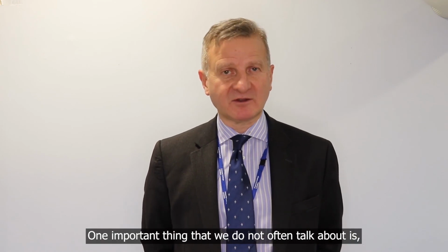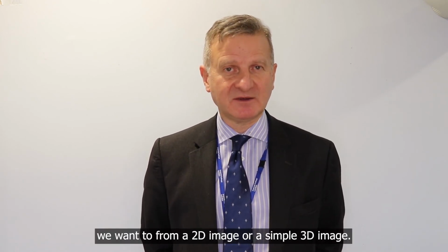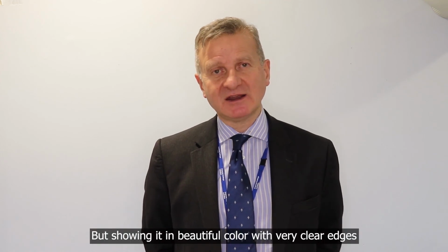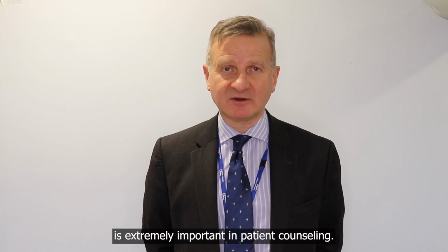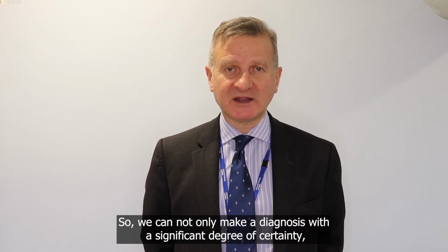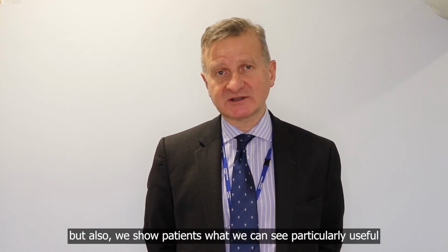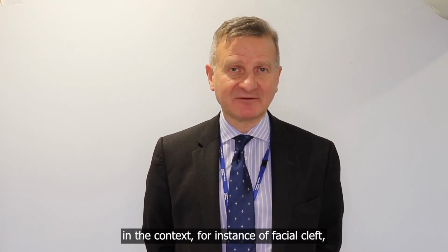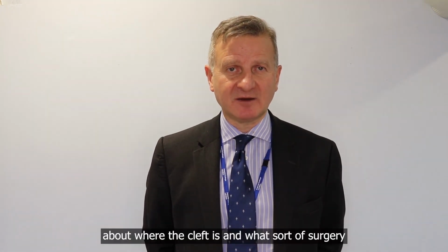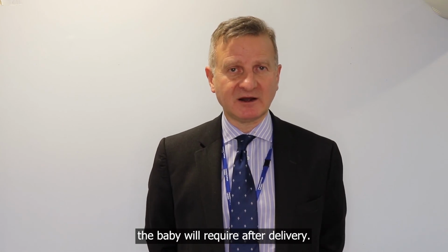One important thing that we don't often talk about is that for us as fetal medicine experts, we can often get the information we want from a 2D image or a simple 3D image. But showing it in beautiful color with very clear edges is extremely important in patient counseling. So we can not only make a diagnosis with a significant degree of certainty, but also show patients what we can see. Particularly useful in the context, for instance, of facial cleft, where mums and dads are often very concerned about where the cleft is and what sort of surgery the baby will require after delivery.